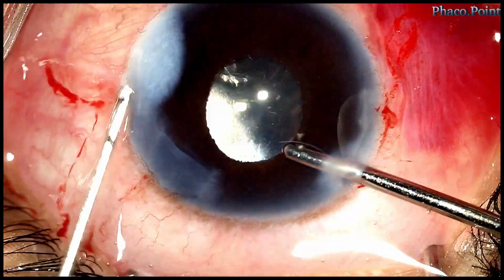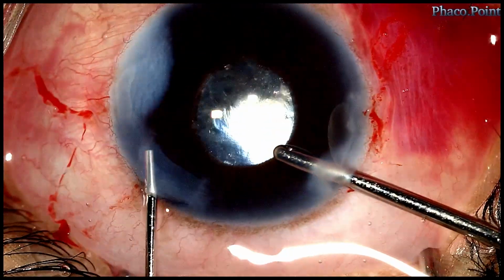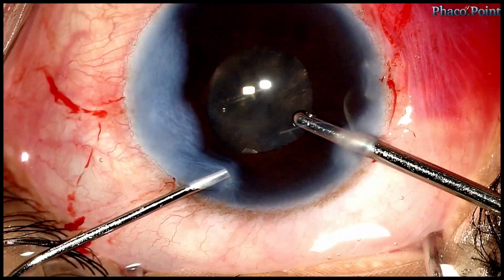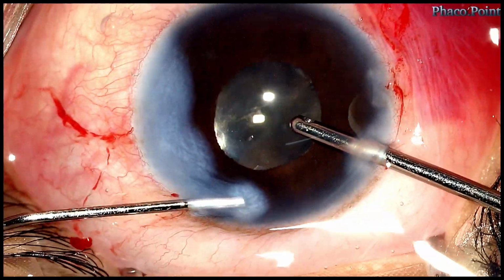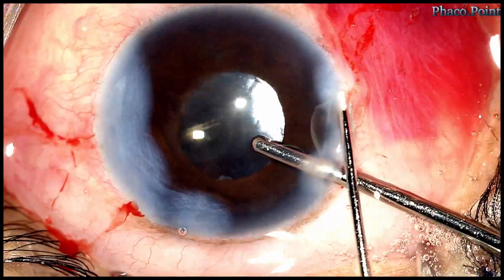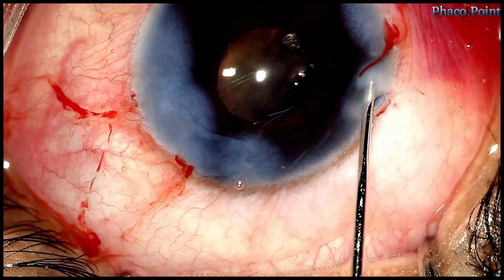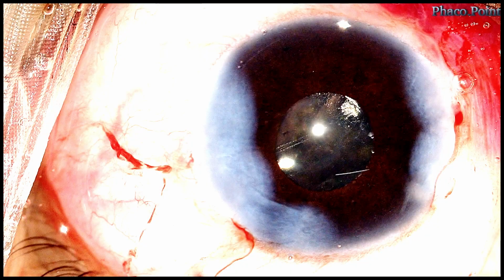Following the completion of the visco wash, whilst maintaining the irrigation still in the eye, the left paracentesis and the main incision are hydrated, at the end of which the irrigation is removed from the eye and the right paracentesis incision also hydrated. And this, as you can see, is the end result that we achieved.